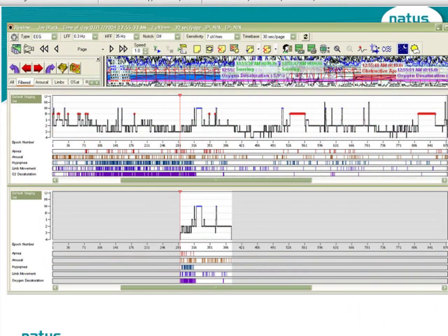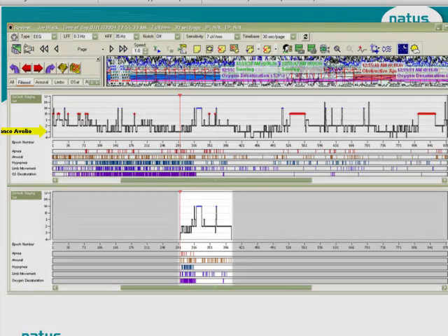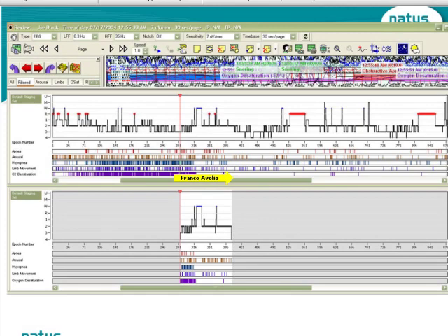Here's a sample study. It's the same study. So what I did was, I took this study here, and these are the results, the hypnogram that was computed by the analyzer. Later, I just took a clip of the study, from here to about here, and I created a prune study. The exact same study. The only difference is, when I ran the analyzer for the whole study, these were my results. When I created a prune study, in other words, I never had this gray portion here. I only had this clip right here, and I ran the analyzer.